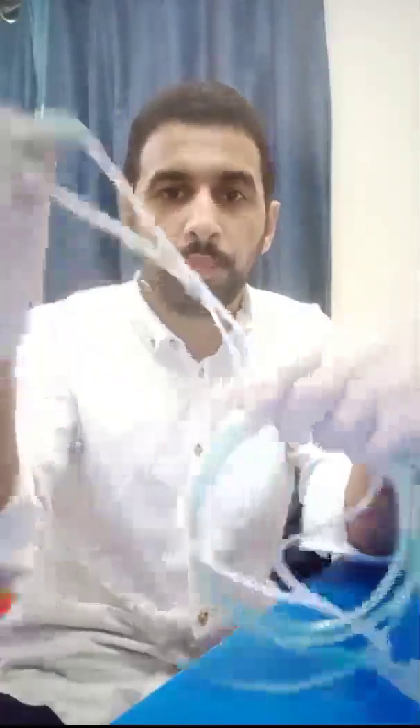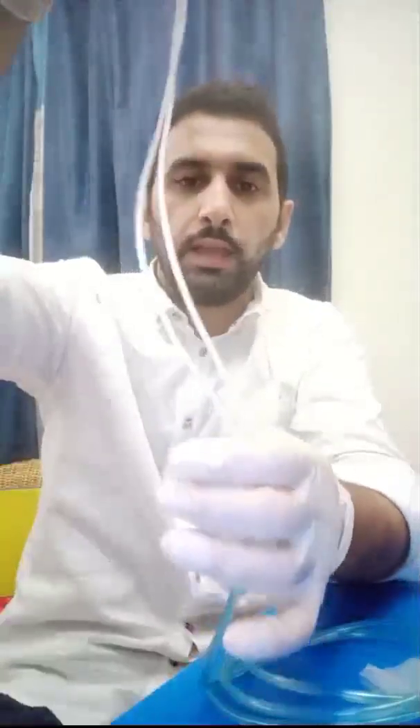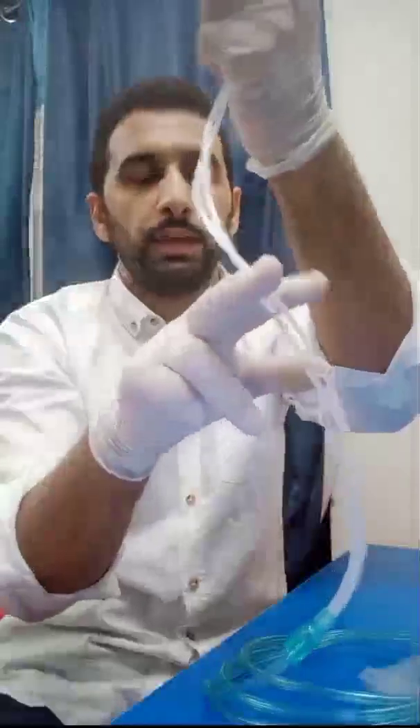Step two: go to the nasal part of one of the nasal prongs and find the bifurcation point. Beyond the bifurcation, you can cut at any level. I have already done the cutting, and I now have a Y-shaped tube.